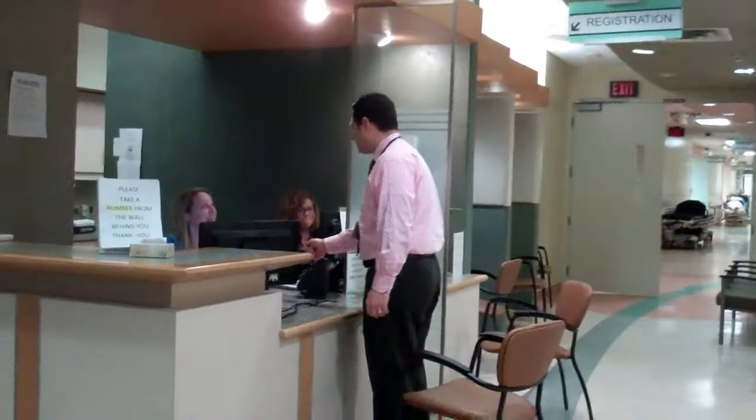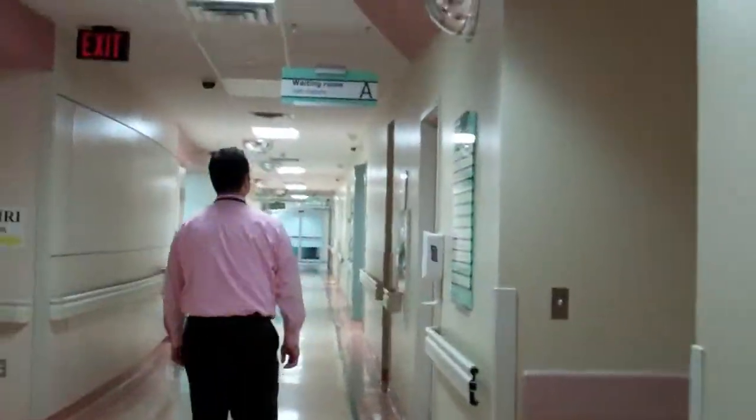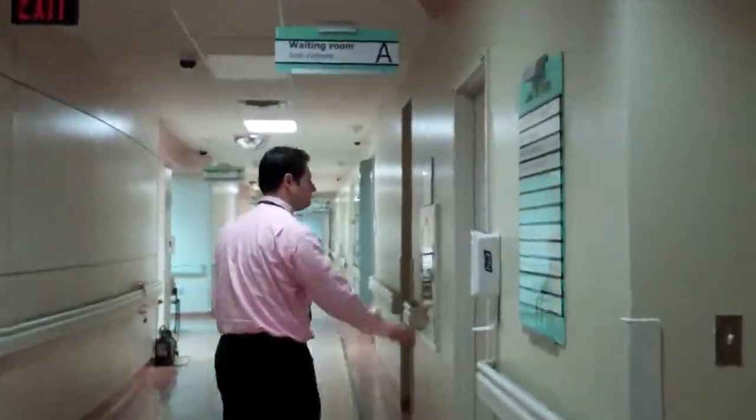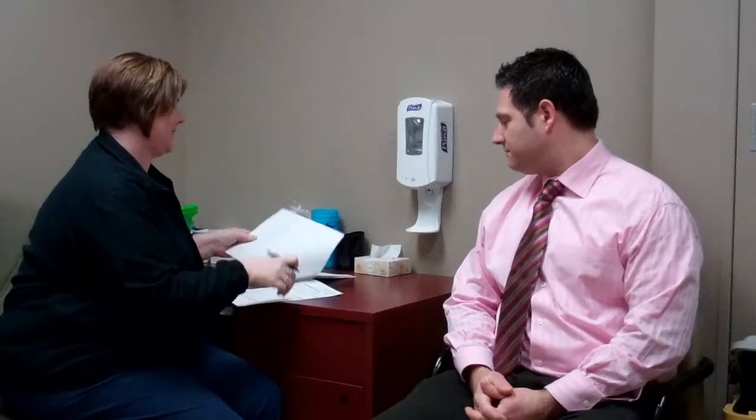When our patients arrive, they are usually greeted by our secretary who will take all of their information and check their health card. The paperwork is then brought to one of the technologists, who will come out and go through a screening form that the patient has already gone through twice — once by their doctor, and a second time by our secretaries over the phone.